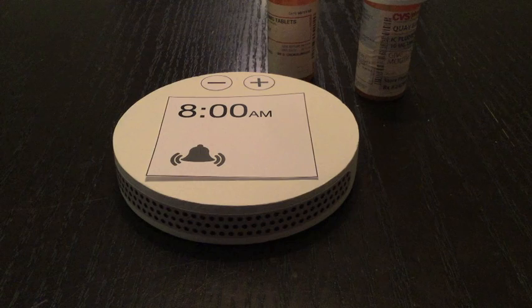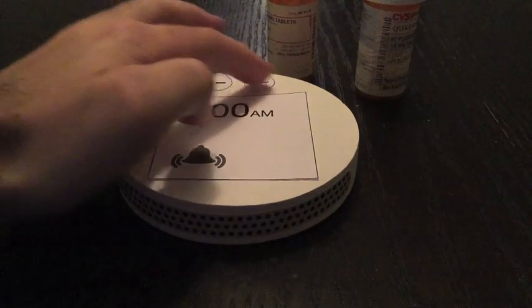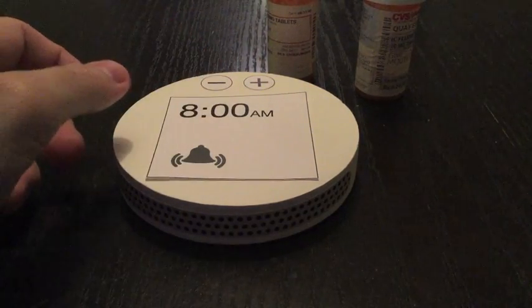The device alerts the user that medication is due. This is done through audible, visual, and tactile responses. The screen blinks, an alarm sounds, and the machine vibrates. The user can silence the alarm by touching the screen or any one of the controls on the device, such as the volume buttons.